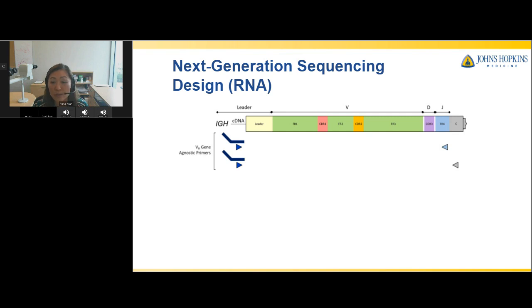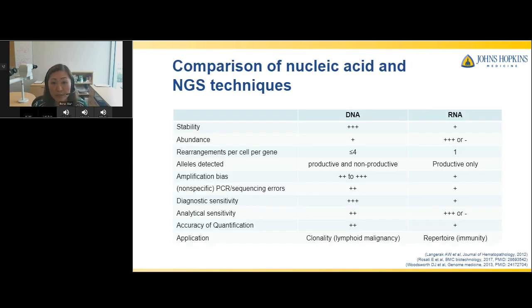So the known gene, quote unquote, in this case, could actually represent the conserved J primers or the conserved constant region primers, which serves as the anchor, as the gene-specific primer. Then the other side is either amplified with a poly-T primer after poly-A tailing, which is a technique called 5' RACE, or after ligating on universal primers, as shown in the cartoon here, that is akin to anchored PCR. So various methods have been developed to sequence the IG genes or TCR genes using RNA based on this type of principle. Now, whether you choose DNA or RNA, you must consider the different possibilities, the pros and cons.